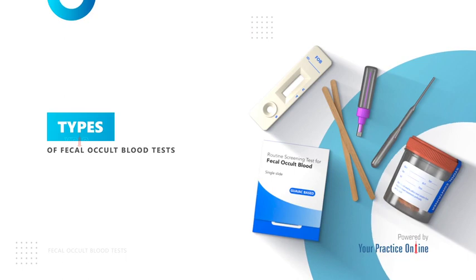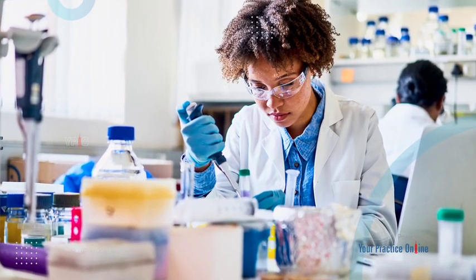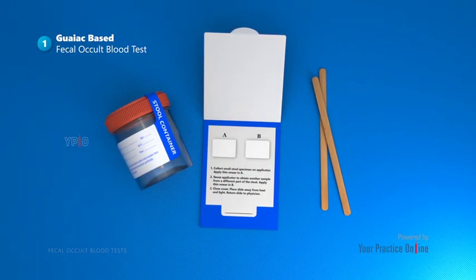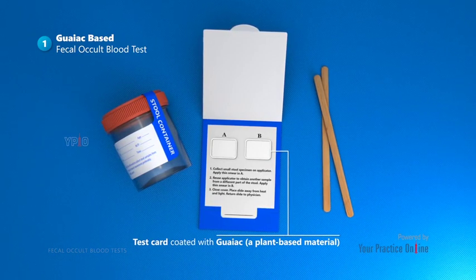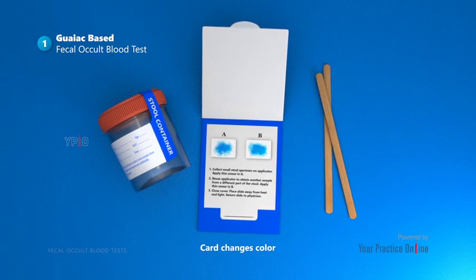Types of fecal occult blood tests. The different types of fecal occult blood tests are guaiac-based fecal occult blood test. This test involves the use of a test card coated with a plant-based material called guaiac. The card changes color when in contact with small amounts of blood.